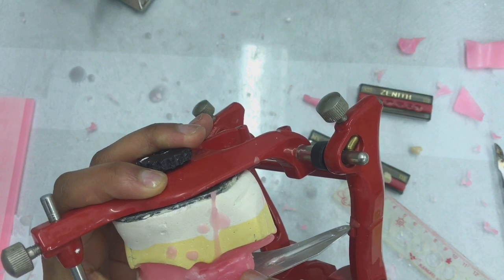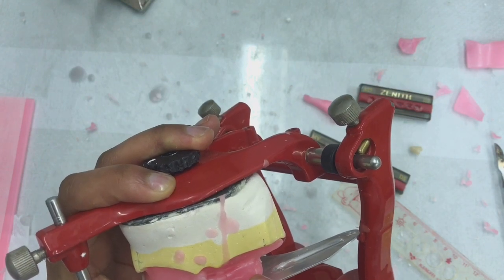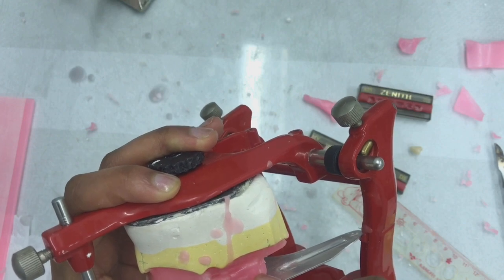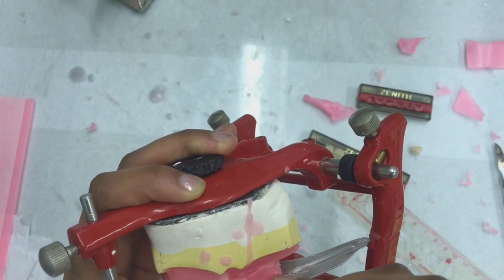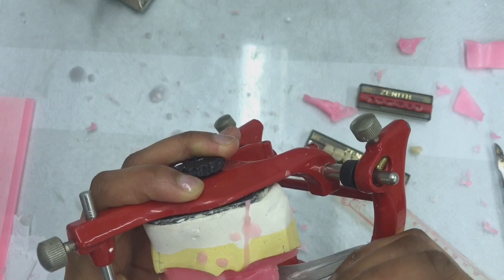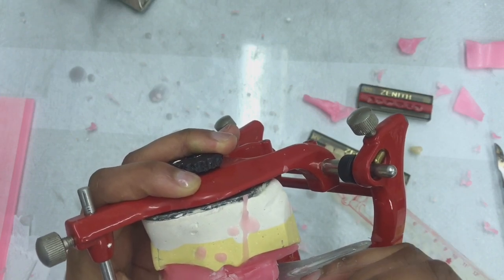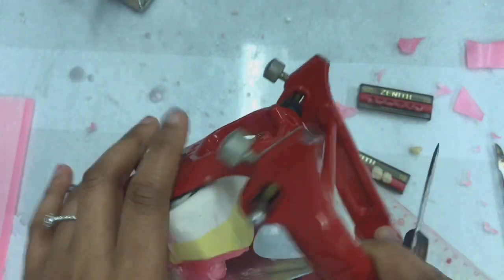You're going to have to do this a couple of times, the tweaking of the tooth. You tweak it until you get it right. There is absolutely no way that you are going to get this the first time around that you position your tooth. So you need to just be patient until you get it correct.